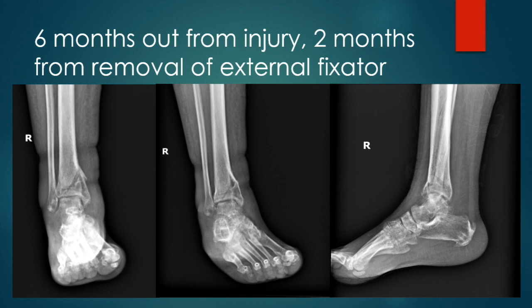But her talus is concentrically reduced underneath the ankle mortise, okay, within the ankle mortise. And she has like a dome, a ball in a dome. And so if she does need something done down the road, an option for ankle fusion in a more limited, minimally invasive fashion is out there now. If you're completely like scrambled eggs and you don't even have axial alignment or some semblance of a mortise, that option is never as effective.